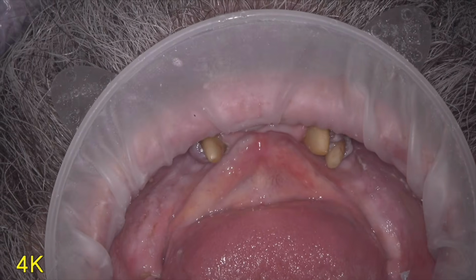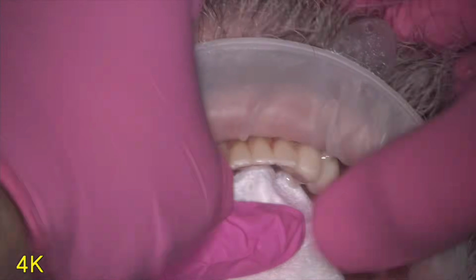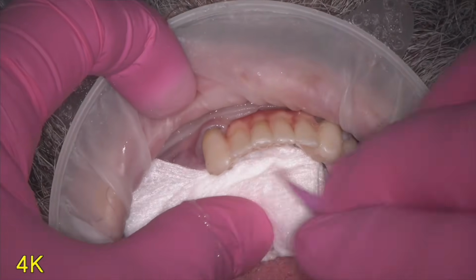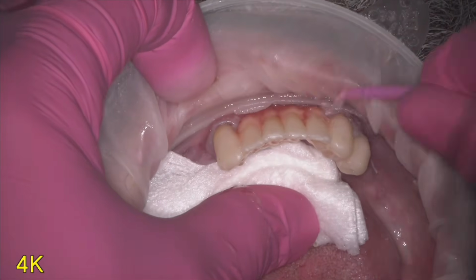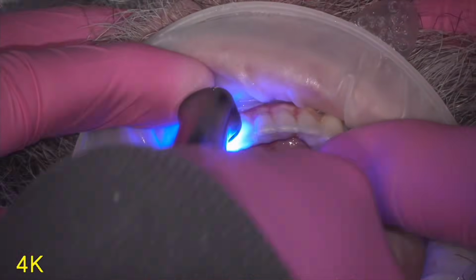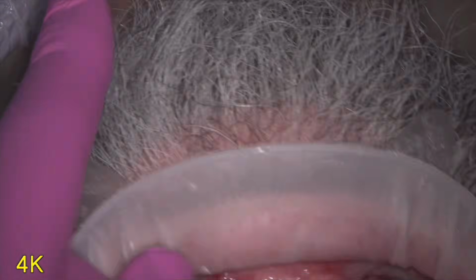So this is the bridge going in. It literally drops right in. No adjustments needed to the fit. Everything's beautiful. I'm going to seat it here, and I'm going to use floss threaders and get underneath the bridge here and clean it all up. And I'm also going to go in between 27, 28 in similar fashion, cure that side, get everything down, snap my partial denture in, put the top denture in place and have them close down.